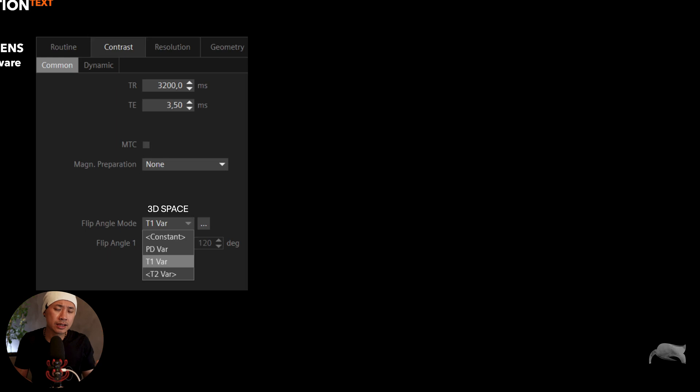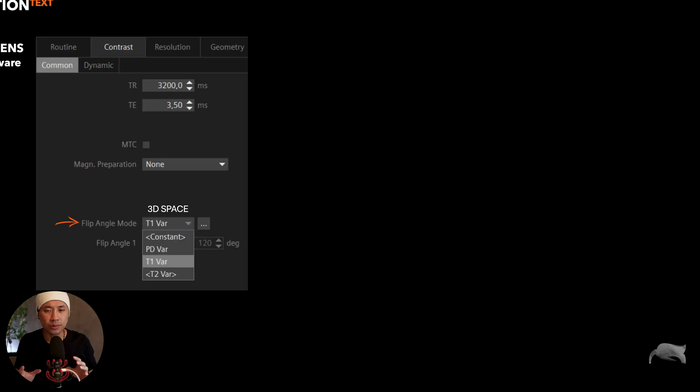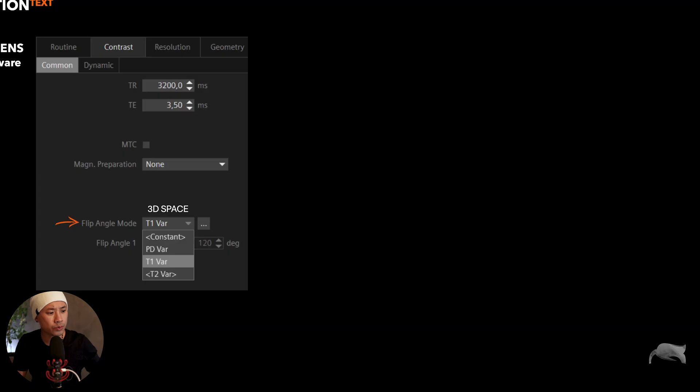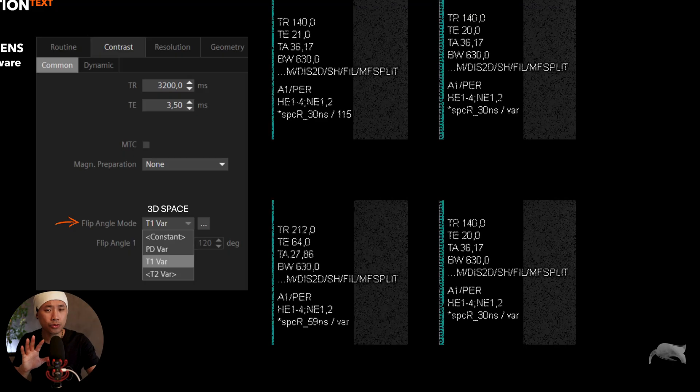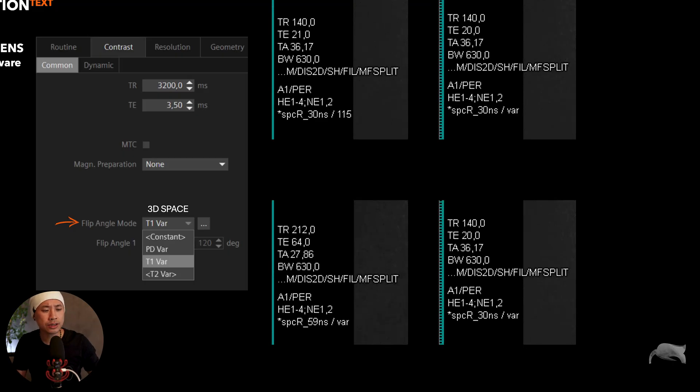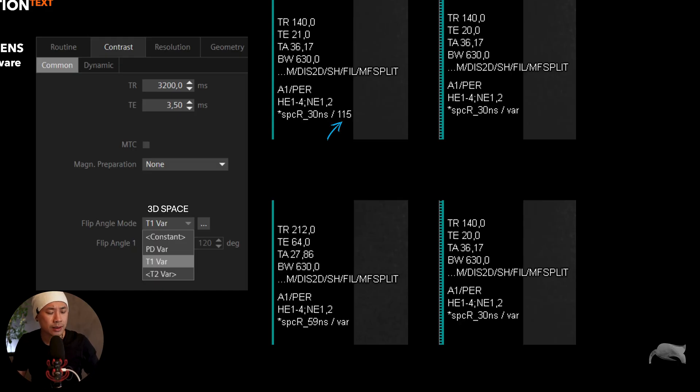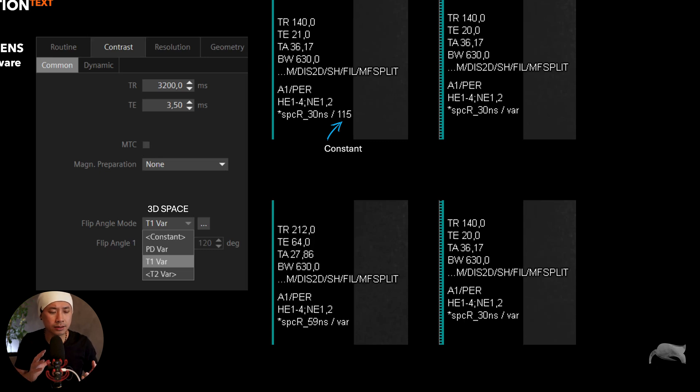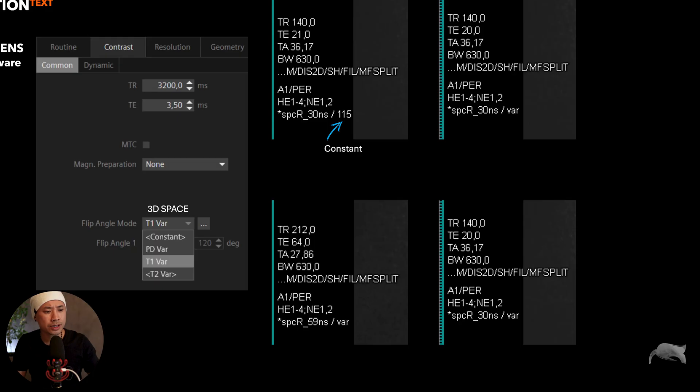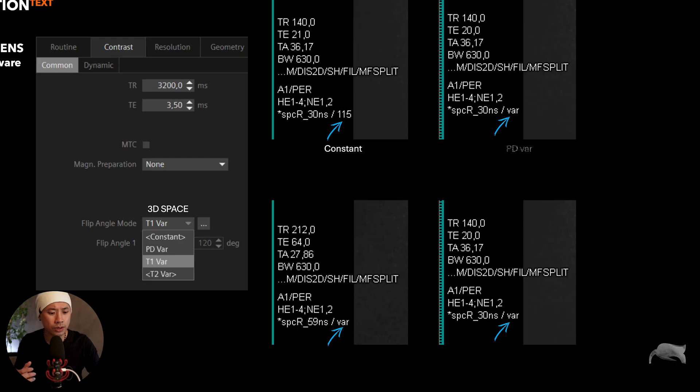Okay, so this is a 3D SPACE. With 3D SPACE you have four different flip angle modes - it depends on what you're imaging, your area, what kind of weighting you want. So you have what we call constant, the PD variation, T1, T2. I'm going to show you four images right here. So this is the four images done with four of these flip angle modes. It's very difficult to tell which is which. One thing you can clearly say is that this one is constant. With the constant, it doesn't say anything else than the flip angle - it's 115 here.